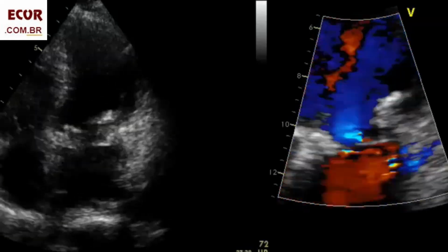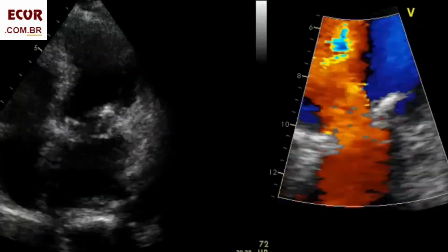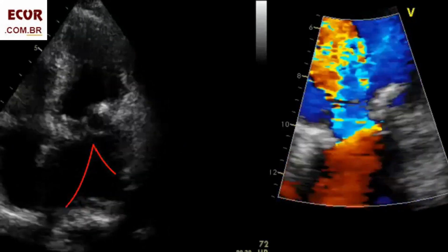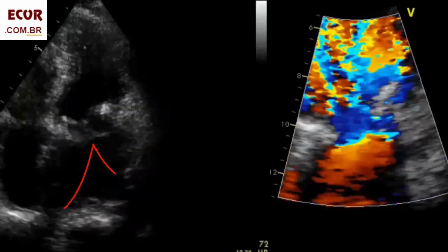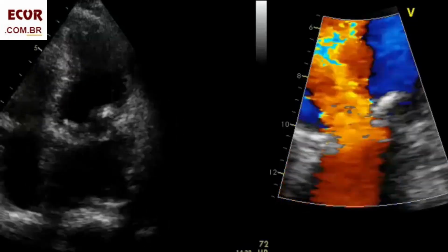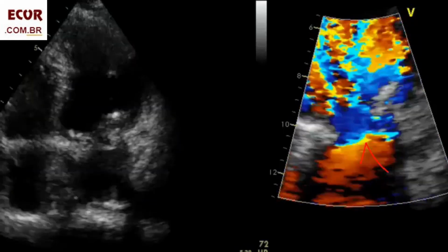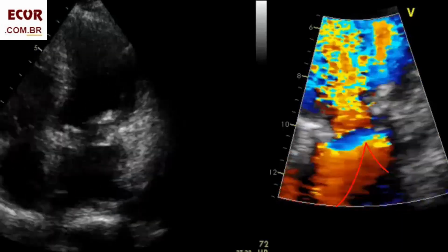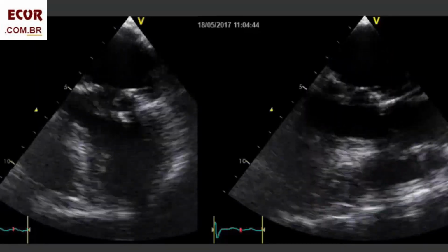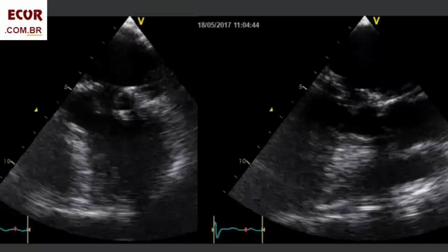Another case, apical four-chamber, shows the basal leaflet to be somewhat fixed with normal movement of the tips. Color flow shows both the stenotic and regurgitant convergence velocities are related to the structure coming from the atrial side of the sewing ring. It seems to be a Pannus. This is confirmed by the TEE aspect.